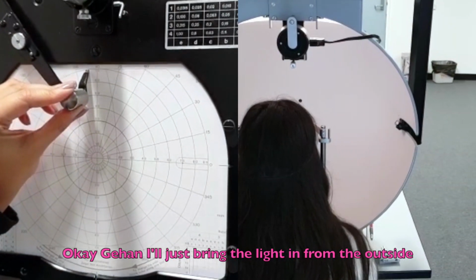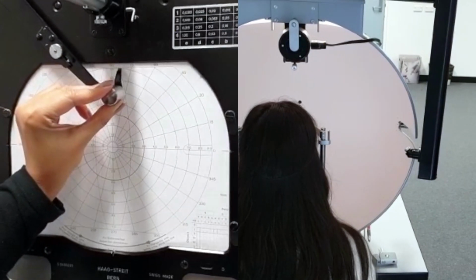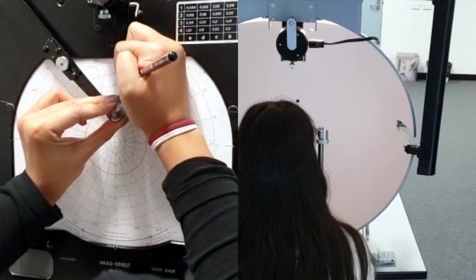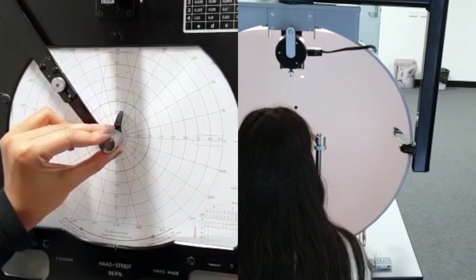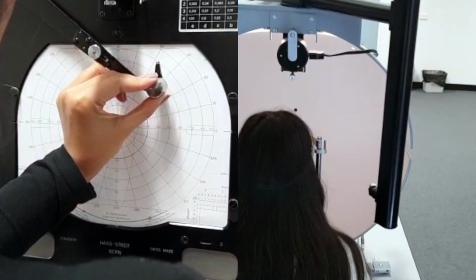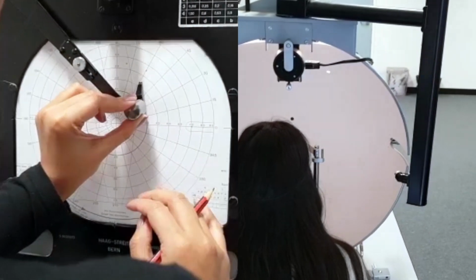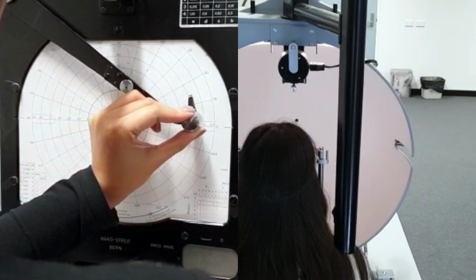Okay, Jihan, I'll just bring the light in from the outside, so just press the buzzer for me when you first see the light. Okay. Right, and just tell me if it disappears at any stage. Can you still see it? Yeah. Okay, that's great. So just again, moving it to a new spot, tell me when you first see the light. Right, and tell me if it disappears at all. No. Okay. Right, so just again, tell me when you first see the light.